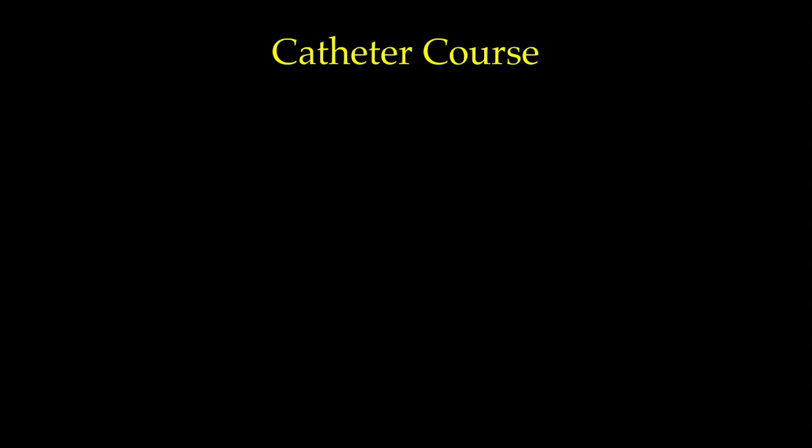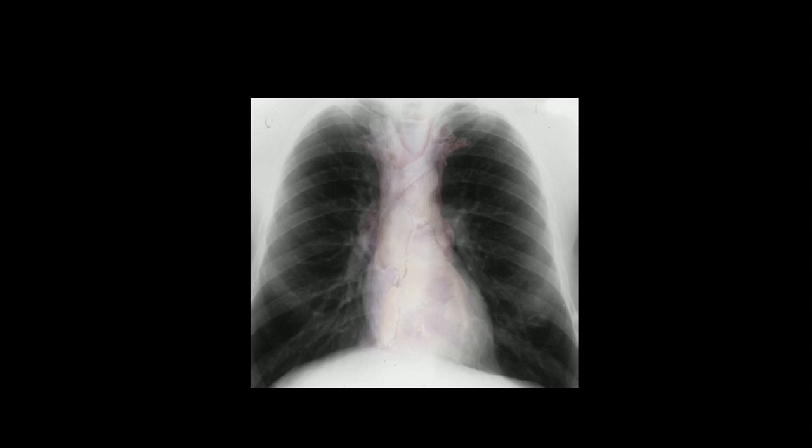So catheter course, we'll do a few questions on these, just to make sure everybody's on the same page. We're all looking at the X-ray of the heart when we're doing our caths. I know this is basic, but I know some of you haven't been in the cath lab in a while. So the catheter comes up, this is typical normal catheter course. If you see this, IVC to RA, and then further up is going to be the SVC. If we find ourselves leftward, we're in the innominate vein.